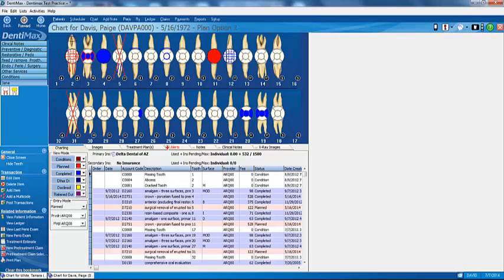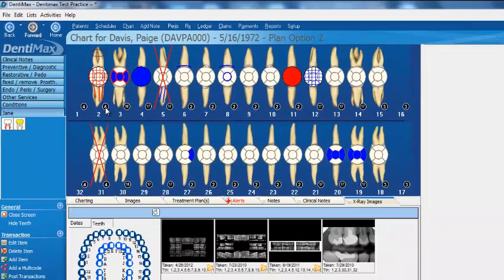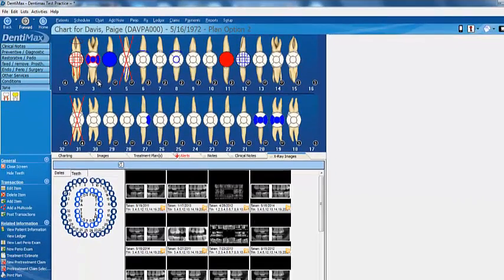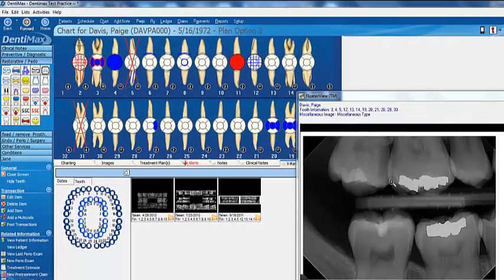Let me show you how we integrate the practice management software to the Dream Sensor. If you're looking at the charting screen, you'll note a number that's not the tooth number. For example, here in tooth number 2, we have a 4 below the tooth. If I click on that, it will bring up the 4 x-rays associated with tooth number 2. Tooth number 3 has 18 x-rays associated, and tooth number 18 has 3 x-rays. Another neat thing is that you can actually view your x-ray while you're doing treatment planning, combining your clinical world with your practice management world.